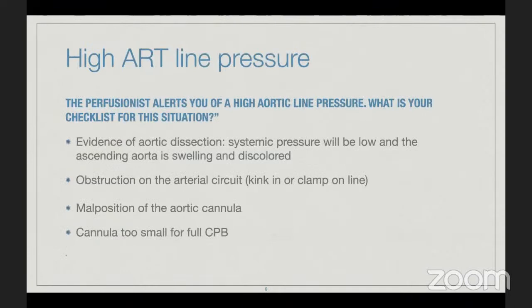Sometimes you can't feel the calcium, and if you have a soft plaque, you're not going to be able to feel it. So that's why it is now standard of care, and it's a class 2A indication, to use an epiaortic scan. So keep in mind, epiaortic scan is important. There are surgeons who use this on a regular basis with every single case to protect themselves. Just get the probe from the TEE people. They will give it to you.